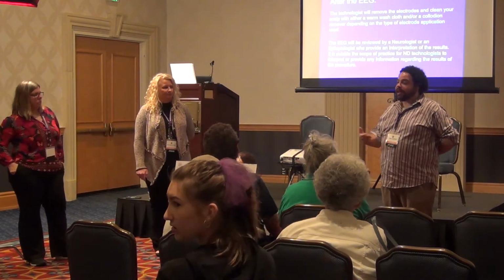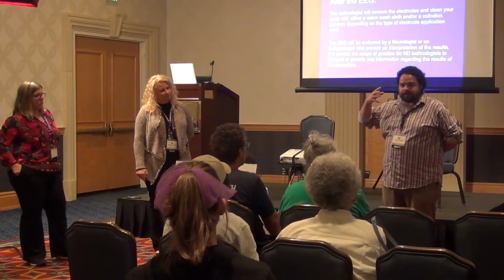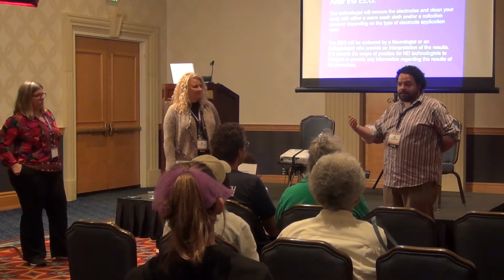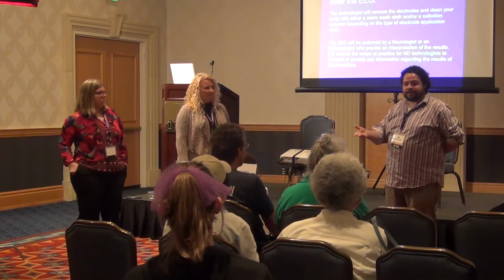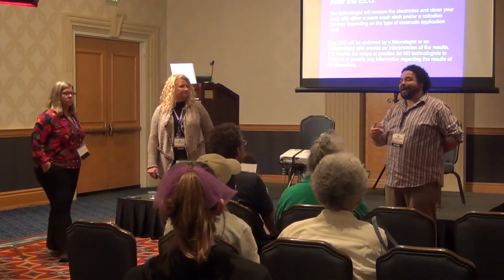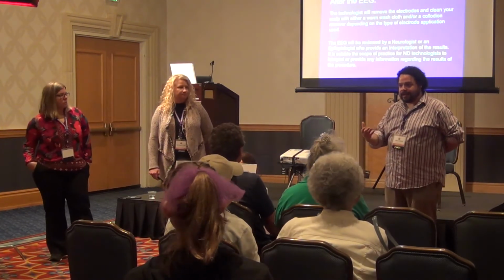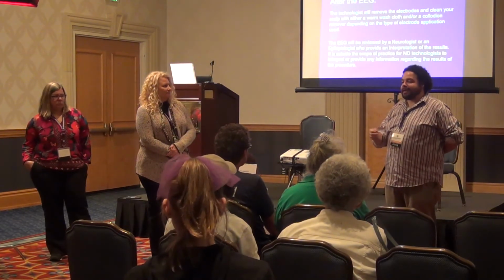With the deep breathing, the hyperventilation, hyperventilating changes the chemical environment of the brain. It gets rid of CO2, carbon dioxide. And changes in the chemical environment as well as other changes in the brain can induce seizures as well. So with anyone familiar with absence epilepsy or absence seizures, the staring spells, 80% of people who have those seizures have one when we do the deep breathing exercises. So it's an extremely powerful tool for us to help elicit that kind of seizure, because if we can elicit it and repeat it, the doctor can see it and know exactly how to treat it.